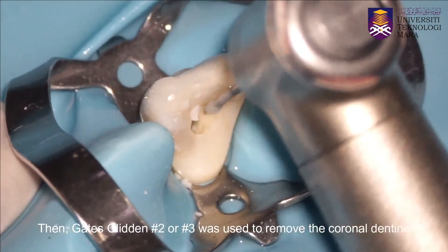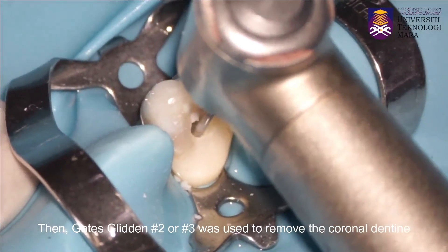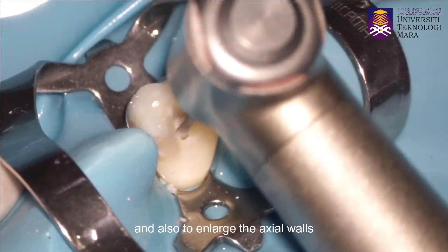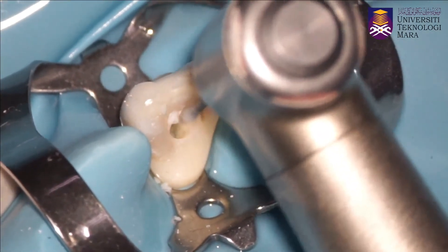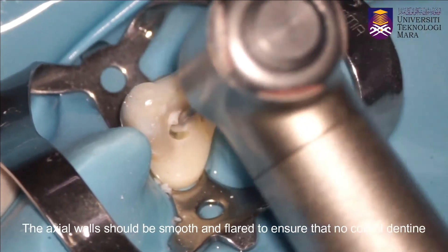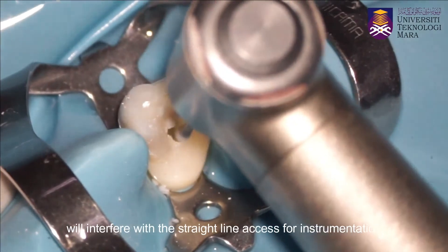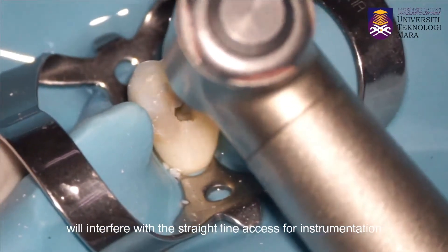Gates Glidden size 2 or 3 was used to remove the coronal dentine and also to enlarge the axial walls. The axial walls should be smooth and flared to ensure that no coronal dentine will interfere with the straight-line access for instrumentation.